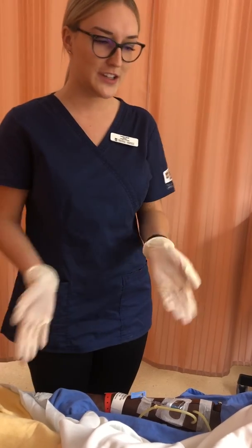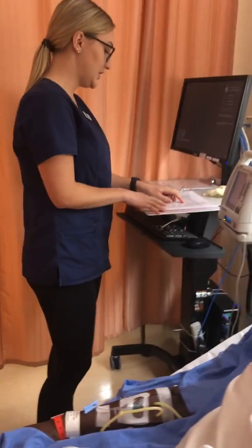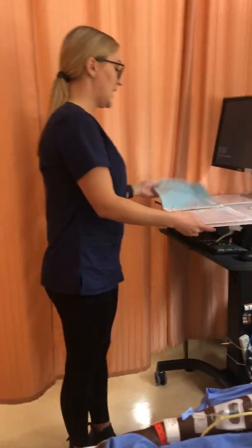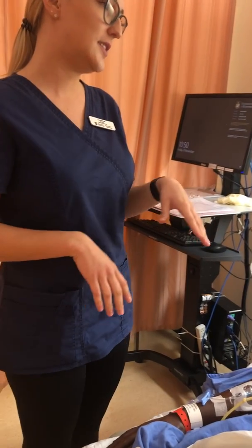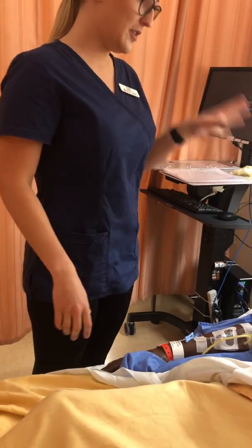Now we're going to move on to the chest tube. So I'm going to take off my gloves here. I've reviewed that there is a doctor's order to change the chest tube dressing every 3 to 4 days, and today is the 3rd day, so we're going to change it for him. The patient has had this before. He declined any analgesics. He says it's not too painful, and he's been educated on what we're going to do. He's consented. He says it's good. So thank you, Bryson.